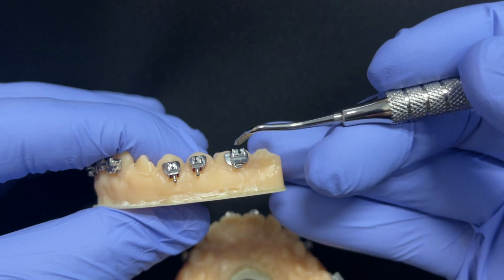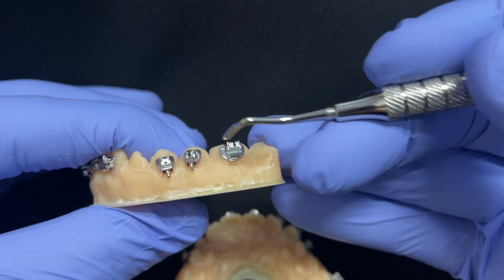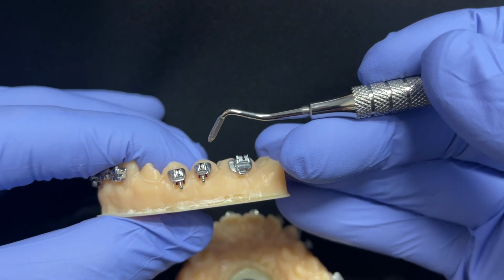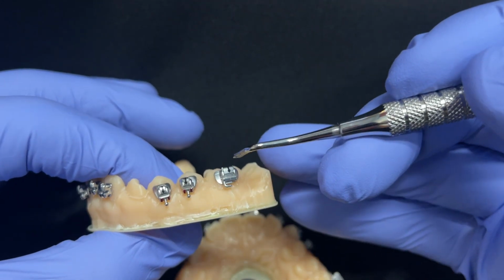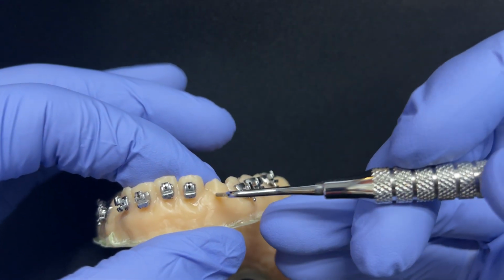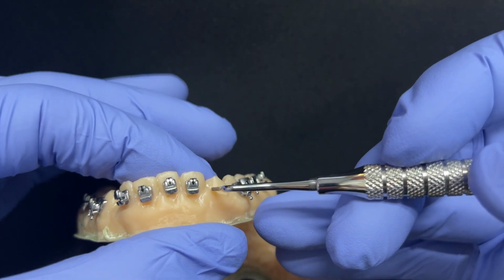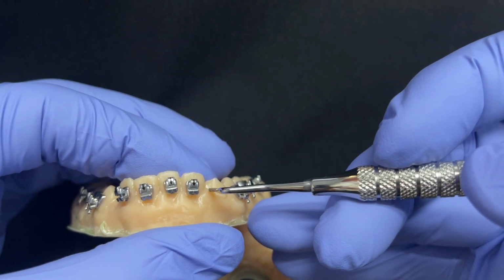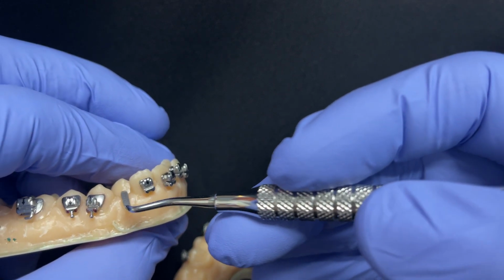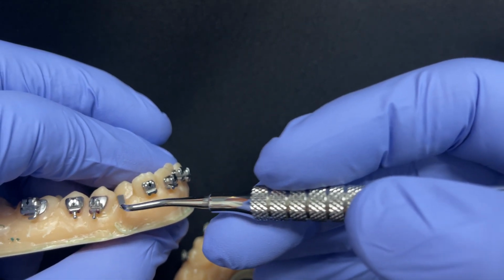So a little stepwise fashion here, and of course we can measure it, but we're at our limit of where we can go on our 5, so I know that that's where we need to be. So 6, 5, 4. The 3 is kind of blocked out. We can't really get a good bracket position on that, so we're going to wait and place that at a later date. Same thing here on this 3. We'll just open up those spaces with some open coil springs.